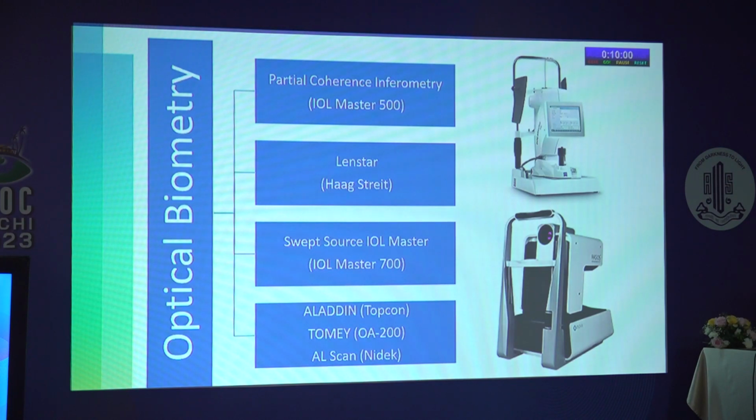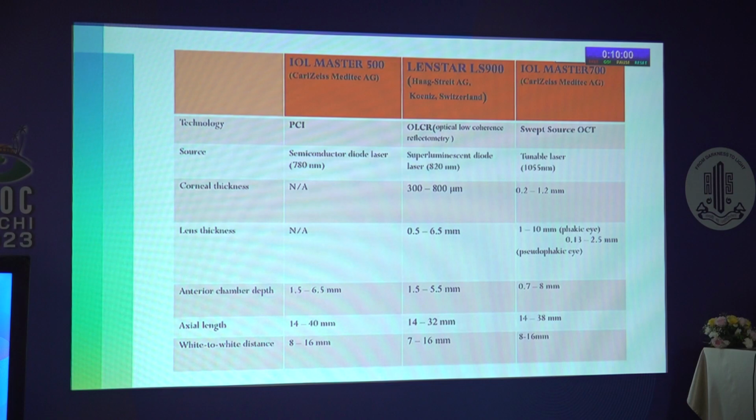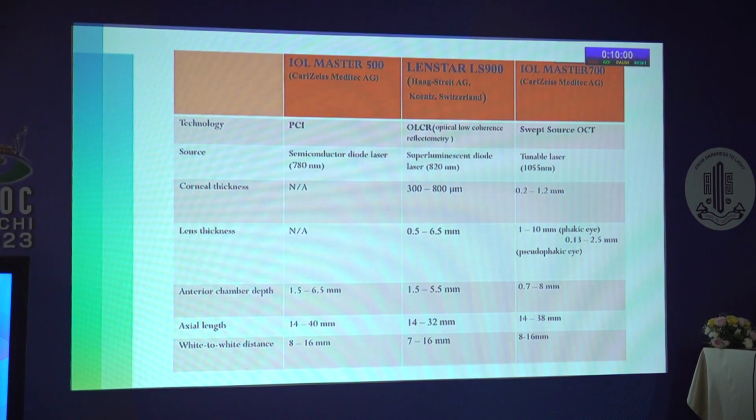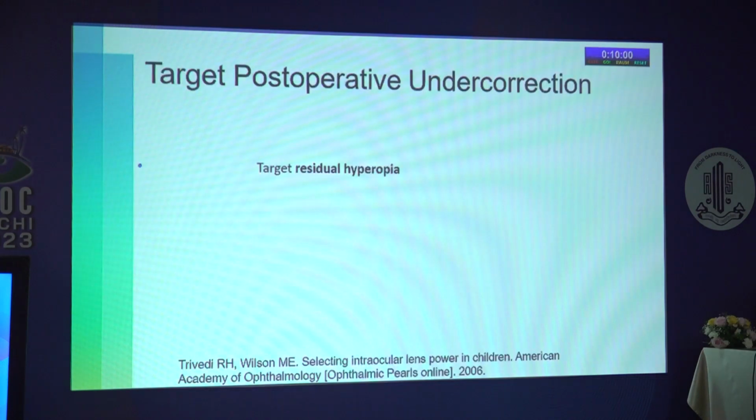This is all with the baby sitting, not lying down. Next. So optical is always better if it is possible in the older children, but the immersion technique has to be done in the young.